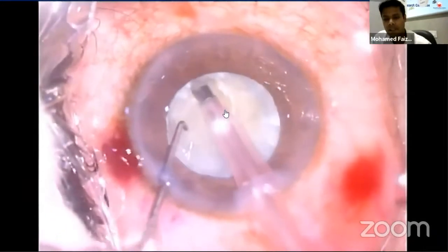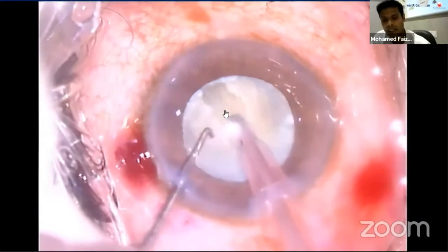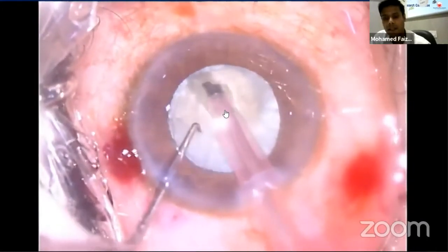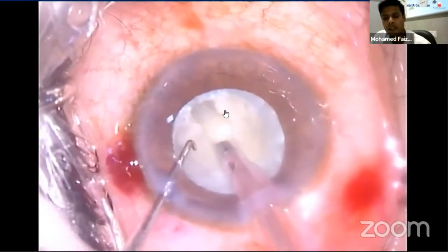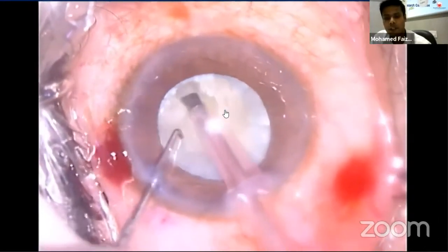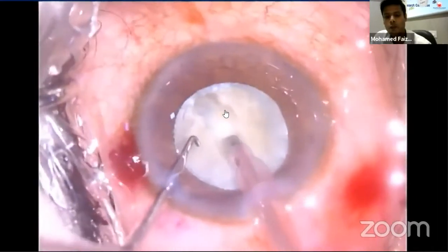During each sculpting motion, the morphology of the lens should be kept in mind — that is, downslope sculpting initially should be followed by upslope sculpting beyond the center of the nucleus. The ultrasound power should be used only during forward movement of the tip, and the foot pedal should return to position 1 during reverse movement.